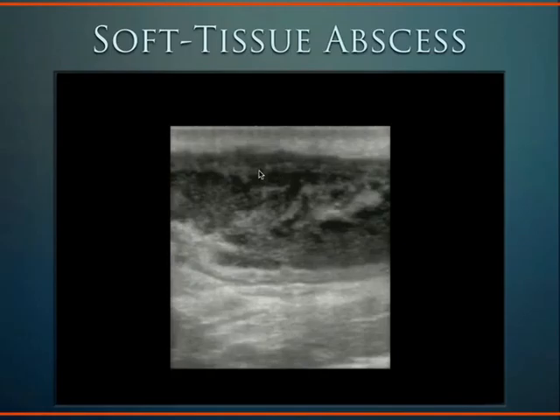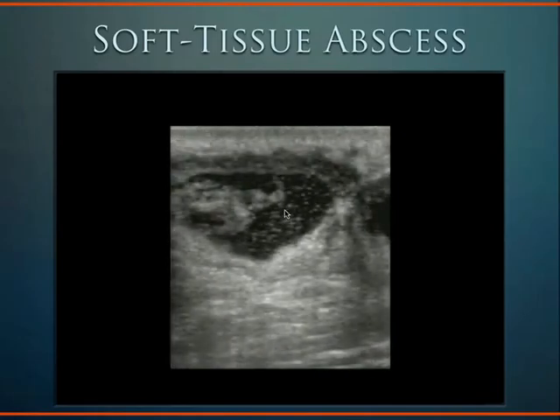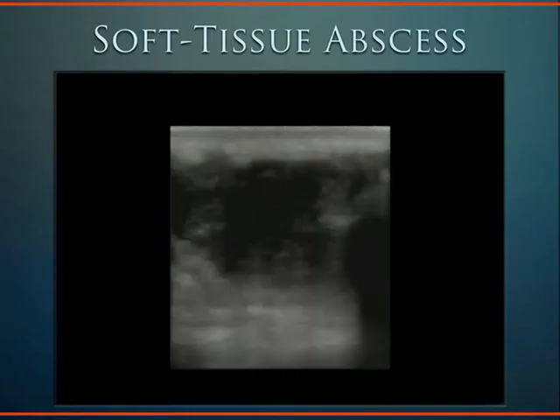This is an abscess. We can see this hypoechoic debris. We can see it kind of layering out. This is what pus looks like. If we compress this area, which causes some discomfort to the patient, we'll actually see this hypoechoic debris swirling around.